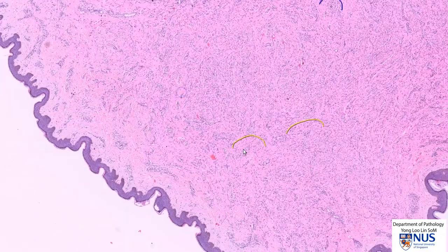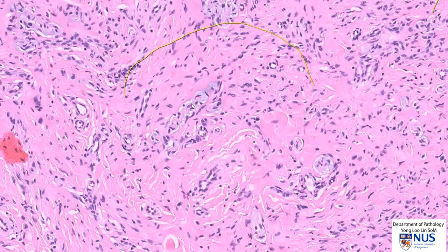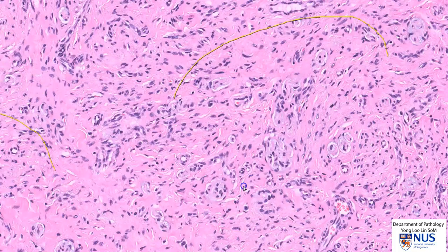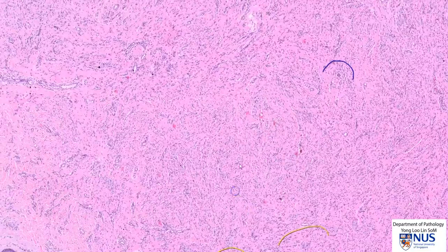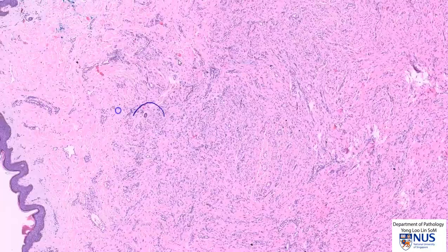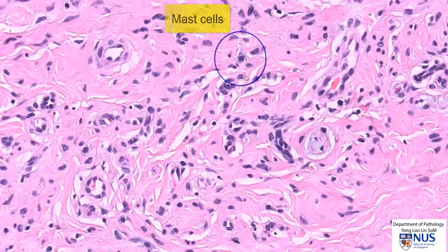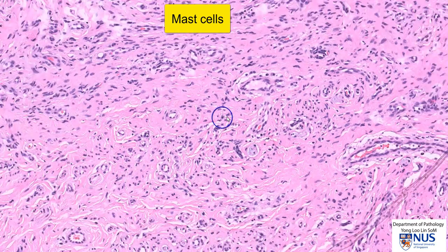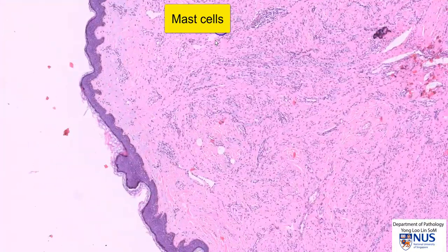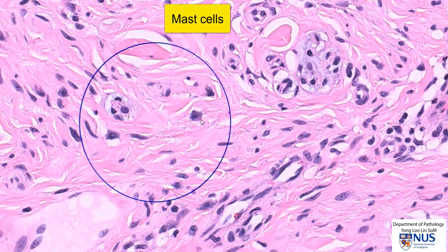We may also sometimes see small neural structures within neurofibromas, and this is not an uncommon occurrence. Lastly, we may also see occasional mast cells quite frequently in neurofibromas. These are recognized as cells with a rather squarish shape, with a very bland nucleus and bluish granular cytoplasm. There is another one here and another one here.